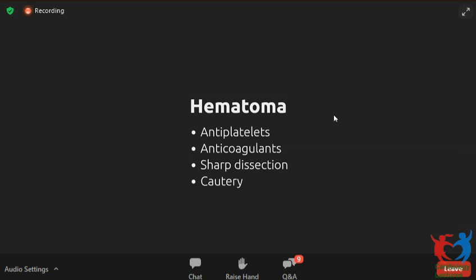Krishna's question is, which site apart from the RV apex do you prefer for the RV lead? Like I said, 95% of the leads we now place in the mid septum. The evolution of our practice has been that 10-15 years back, all leads were placed in the apex. Then we started putting leads in the RVOT in patients with congenital heart block and younger patients. Compared to the RVOT, the mid septum is a little easier to do and is a more stable position. The RVOT hangs from higher up and there's a slight chance of dislodgement. Mid septum tends to be a much more stable place, and you get a nice narrow QRS with both. So now our preferred approach, 90-95% of RV lead placements, is in the mid septum.